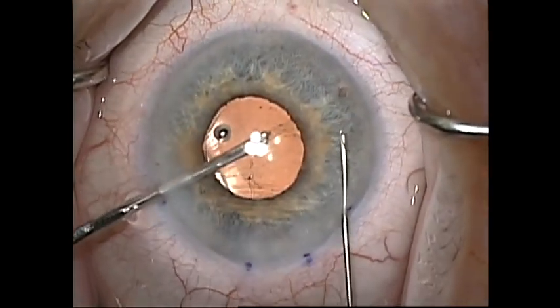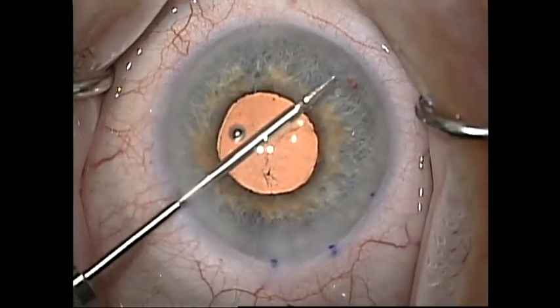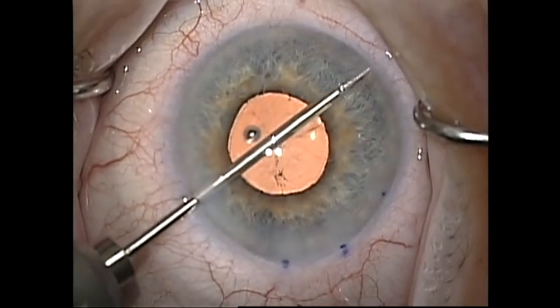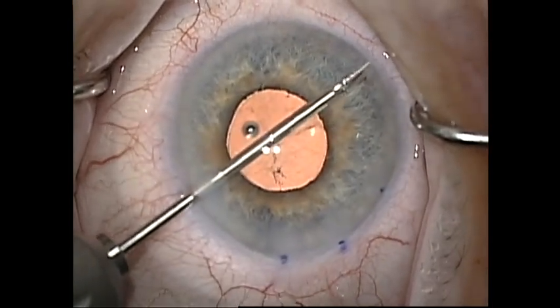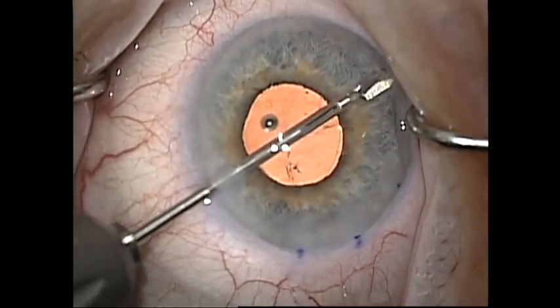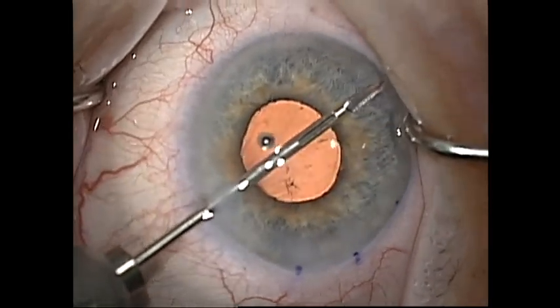Disposable micro scissors can be used but I prefer to use the reusable scissors from Microsurgical Technology. I like to make two snips towards the periphery of the angle and then remove a small portion of tissue to be sure that I remove some pigmented portion of the iris and have a fully patent peripheral iridotomy.